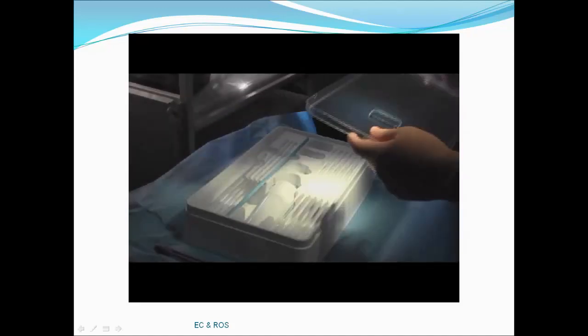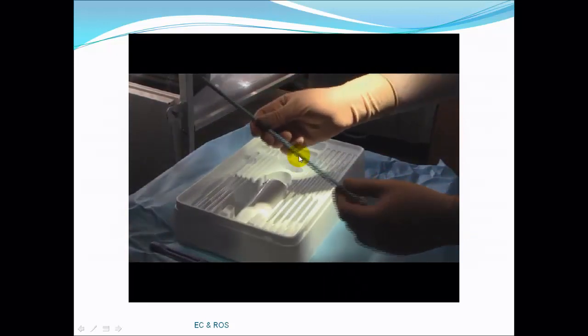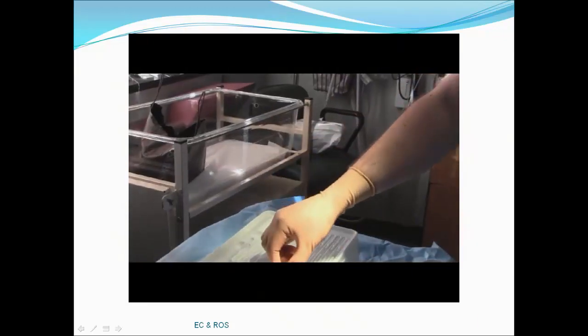Here is a disposable fetal blood sampling kit. Be familiar with its contents. Lay the contents out aseptically prior to commencing the procedure. The kit contains the blade holder, long swabs for the application of soft paraffin to the fetal head. These can also be used for cleaning the fetal head.